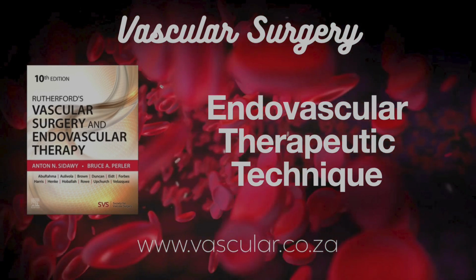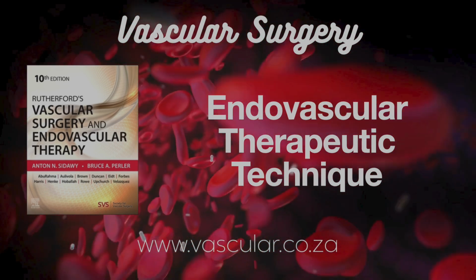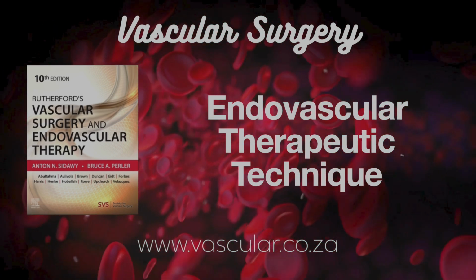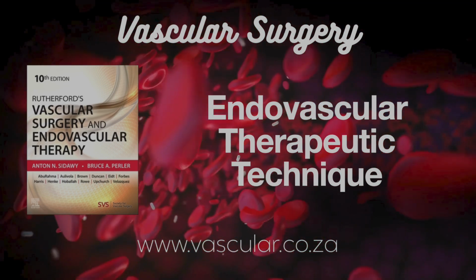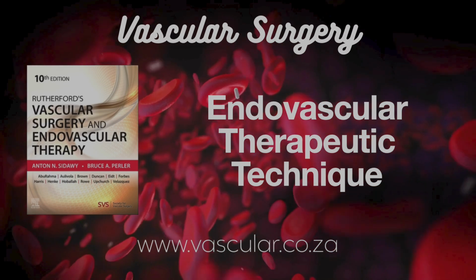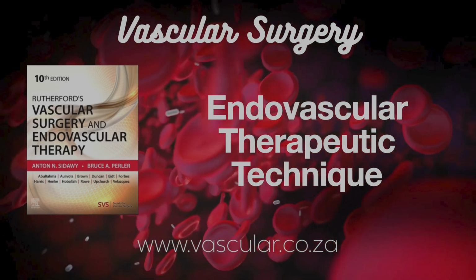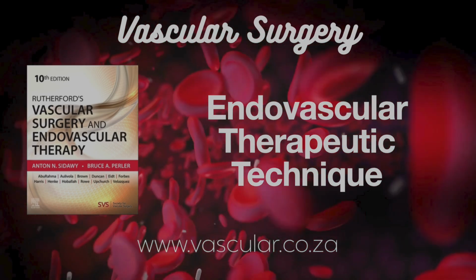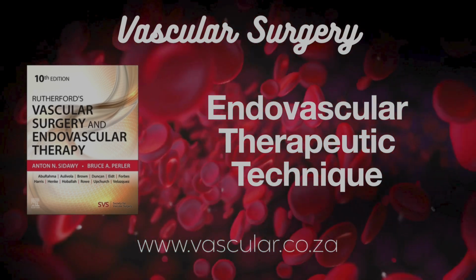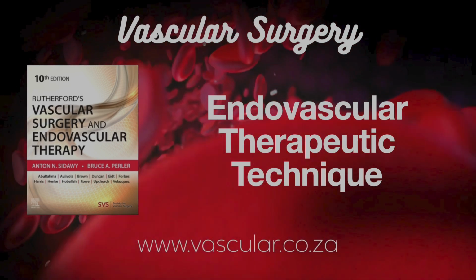Directional atherectomy systems like Silverhawk and Turbohawk use a small, sharp carbide cutting blade inside the catheter. It rotates at high speed, up to 8,000 RPM, to literally shave off the plaque. And where does the shaved off plaque go? Good question. The catheter has a collection chamber, a nose cone, and a plunger system to basically suck up and remove the debris, the atheroma, from the body. Turbohawk is beefed up for tougher calcium. Delivery system, standalone treatment. Usually monorail catheter, 0.014-inch wire, 6/8 French sheath. And yes, sometimes, especially with softer plaque, it can be used alone without needing balloons or stents afterwards.